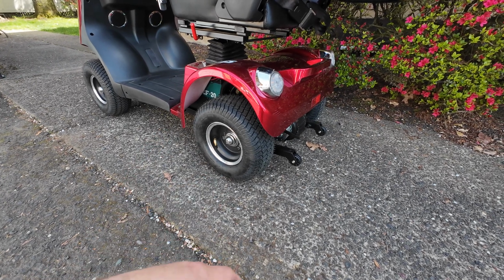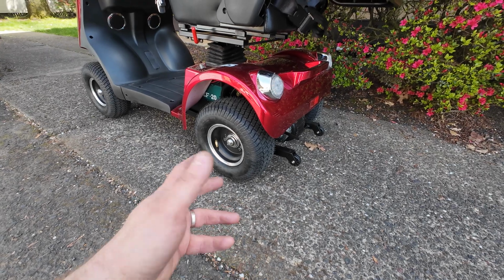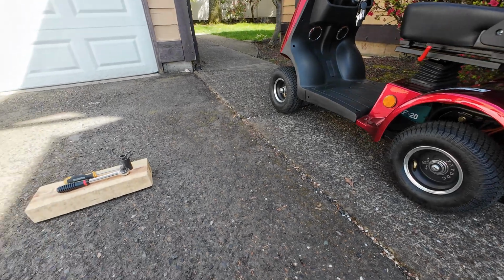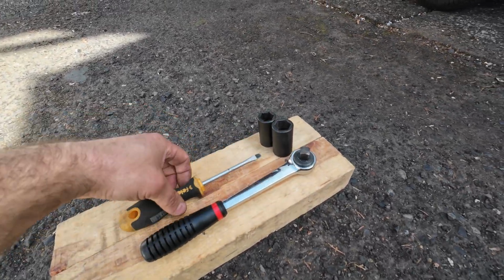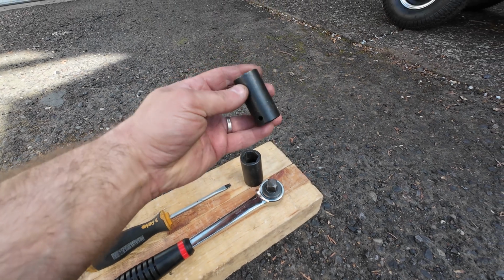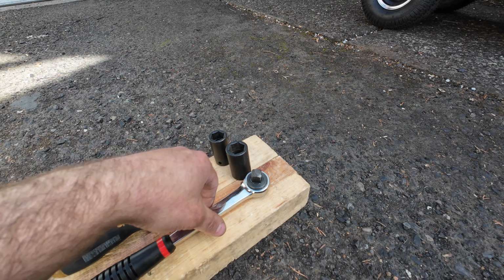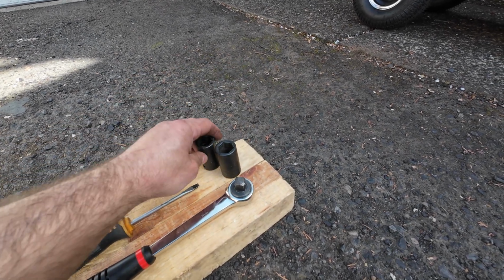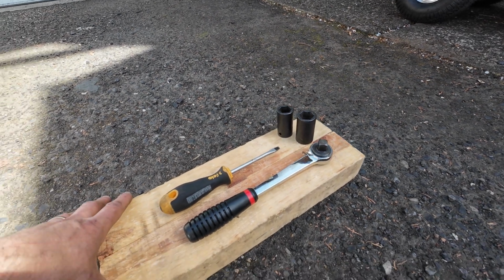For many of you it's pretty obvious, but for some of you who never did it before, you have to know what to do and what kind of tools you need. So this is what I'm going to use: a 1/2-inch ratchet, a flat screwdriver, a 19mm semi-deep or deep socket, or you can use a short socket with the extension, and 21mm. So 19 and 21, those are essential tools. Without them you cannot remove anything.